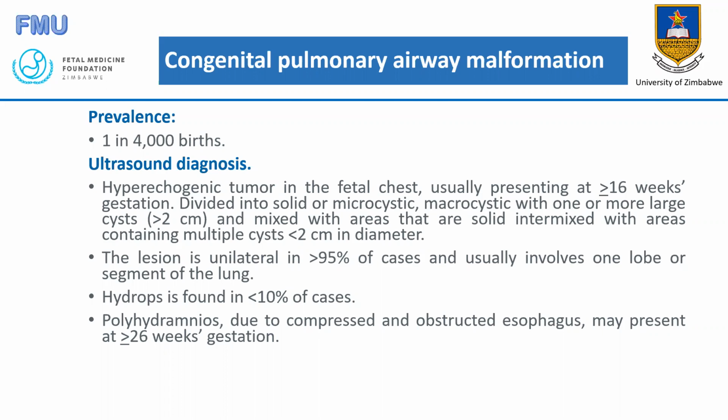We normally see a highly echogenic tumor in the fetal chest. Tumor is not equal to cancerous. Some may think, so it's a cancer. No, tumor just means it's a lesion. It's not cancerous. It usually presents after 16 weeks gestation. It can be divided into solid, microcystic or macrocystic, with one or more large cysts, and mixed, with areas that are solid intermixed with areas containing multiple cysts of less than 2 centimeters in diameter. So this is the condition from which you need to distinguish bronchial cyst.